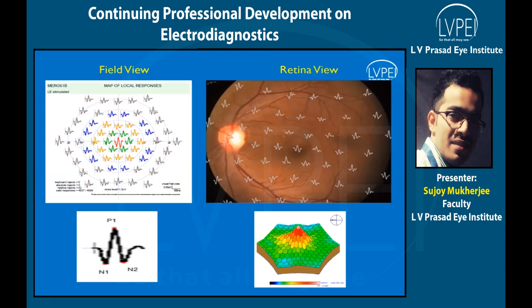Dr. Tapas, please go ahead. Multifocal ERG is a lot dependent on the patient's cooperation. If you don't have cooperation, then the recording will be meaningless. So in nystagmus, you won't get adequate information on that. I would not advise multifocal ERG for nystagmus.